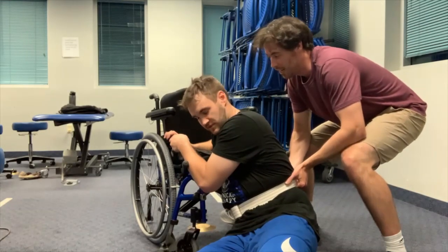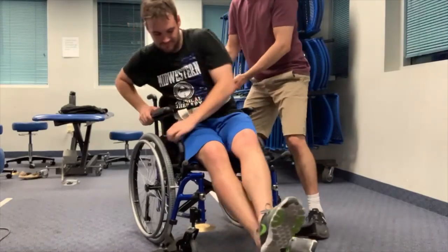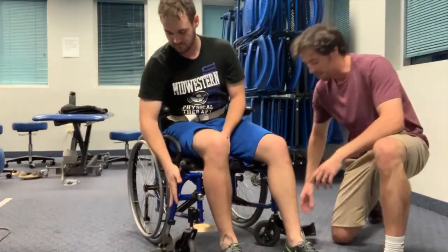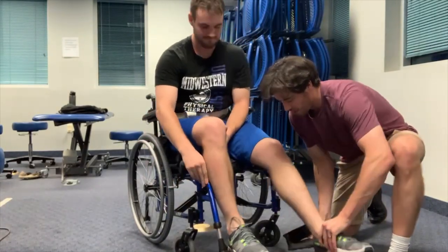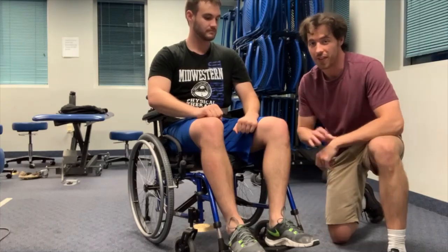So we're going to go on three: three, two, one, and go. Excellent. And then from there he can go ahead and get his legs into position. We might as well go ahead and help get the front rigging into position for him, and now he's nice and secure. So I think that would be the best way to go about this.